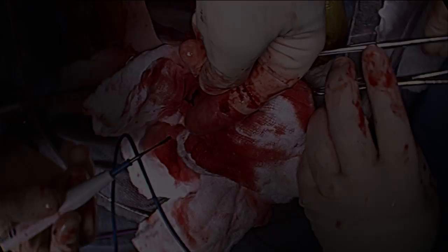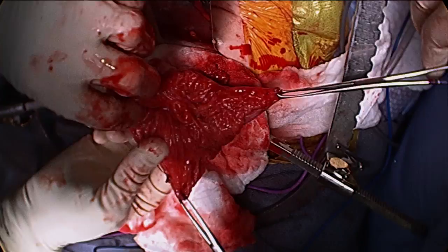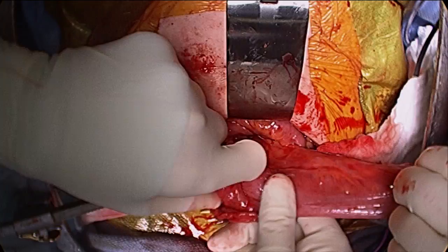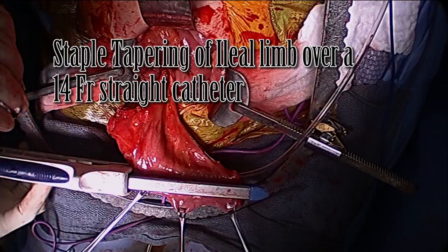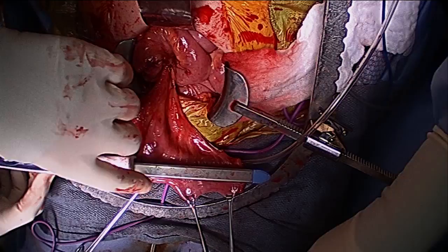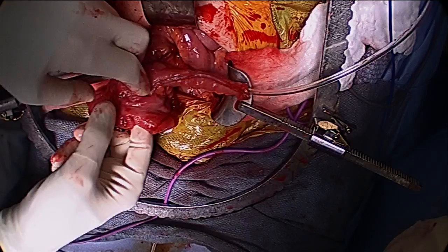The cecum is then detubularized with the bovie. Note the difficulty in passing the straight catheter through the native ileal limb. The ileal limb is then tapered over a 14 French straight catheter. Freehand stitches are applied to taper the proximal end near the ileocecal valve. Note the improved efficiency of catheterization.